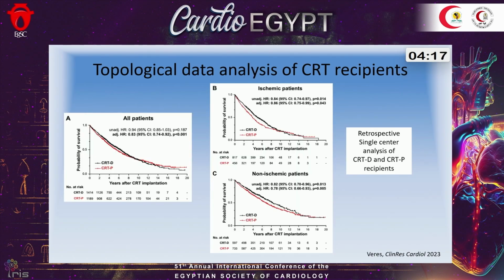And this is the last topic, which is really interesting. There are close to 2,500 patients involved. It is a retrospective single-center analysis of CRT pacemaker and CRTD recipients.